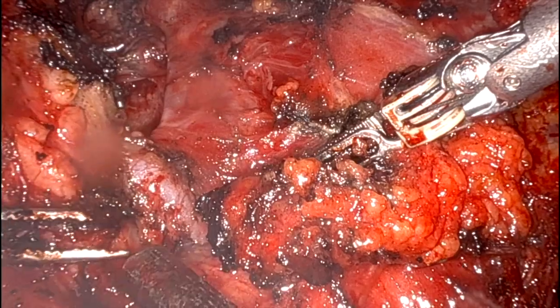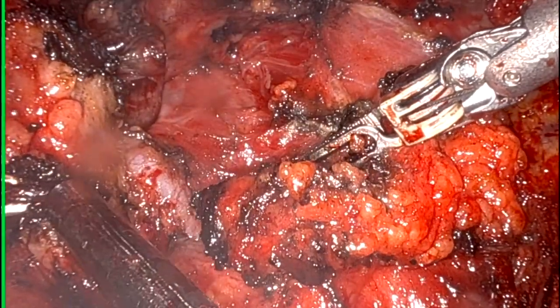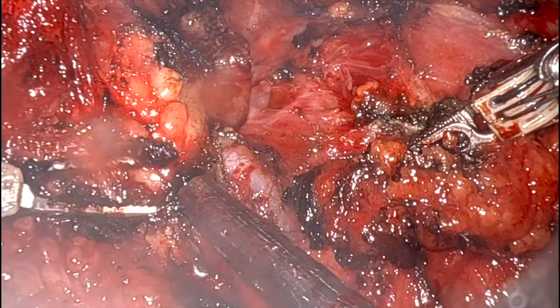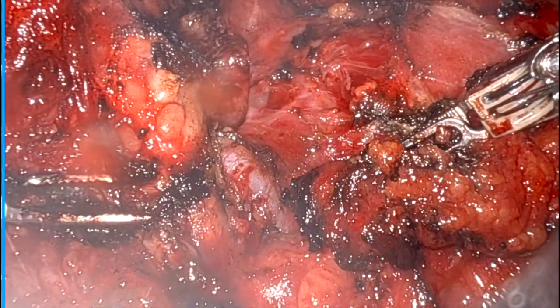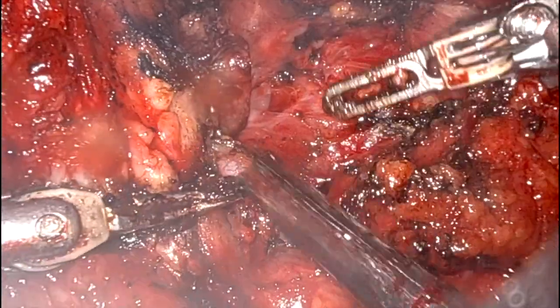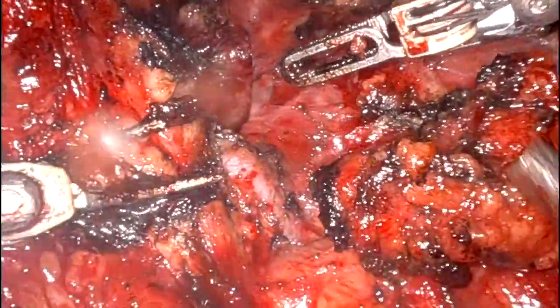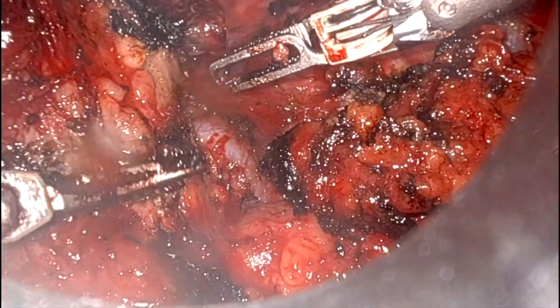If you see this vein carefully, it is crossing the digastric muscle. If I clip this vessel, I will directly land upon internal jugular vein and the hypoglossal nerve. But today we are going to preserve this.